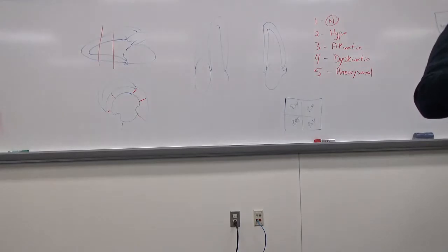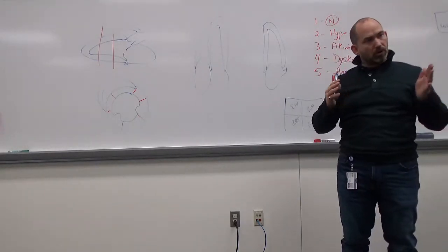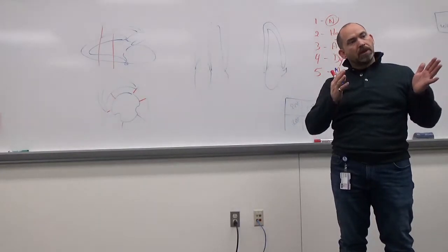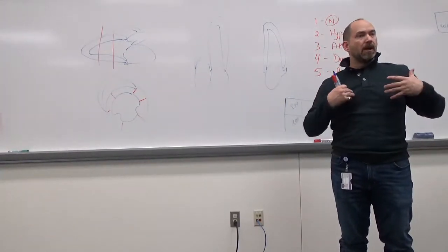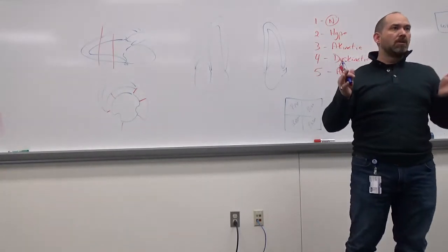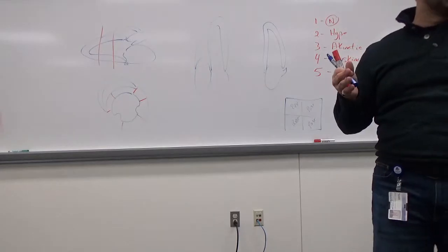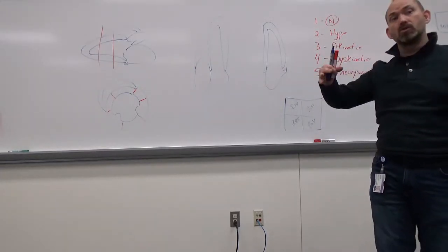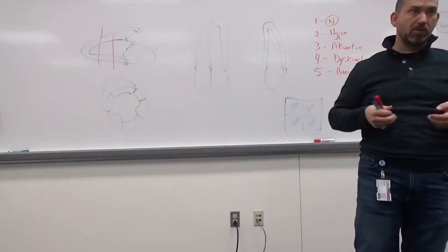Now, the one caveat is when we take it. If we're doing a treadmill stress test, for example, and we stop the treadmill, we get them over to the bed, we struggle getting our images. If you take more than that 90 seconds, it can return to normal. Okay, so if I've gone too long, it could be back to normal because I missed my window of opportunity.